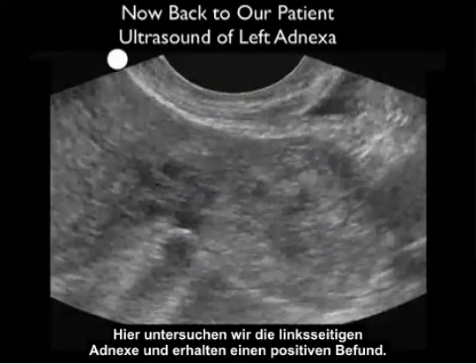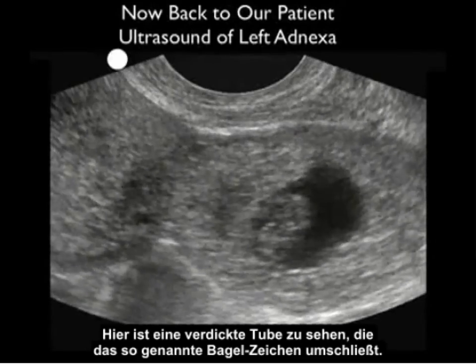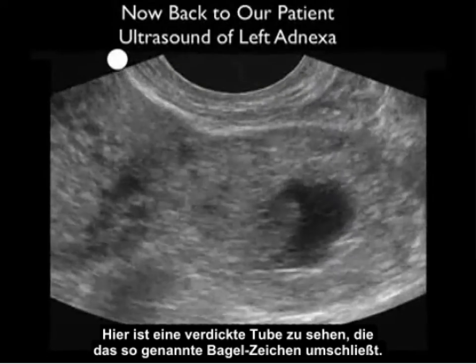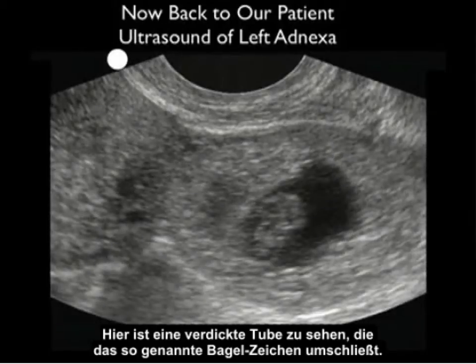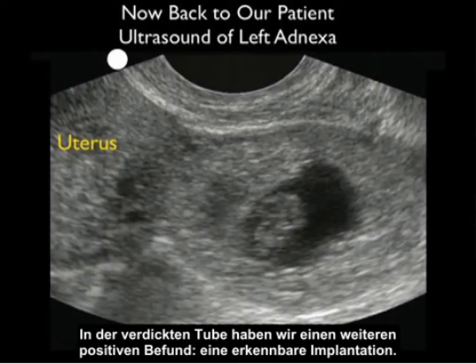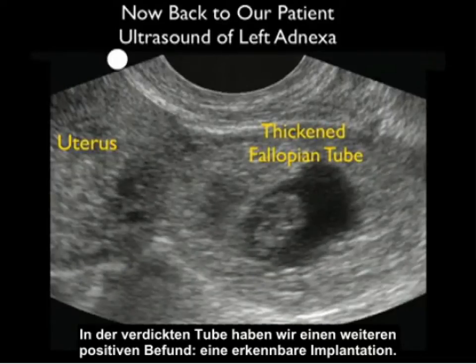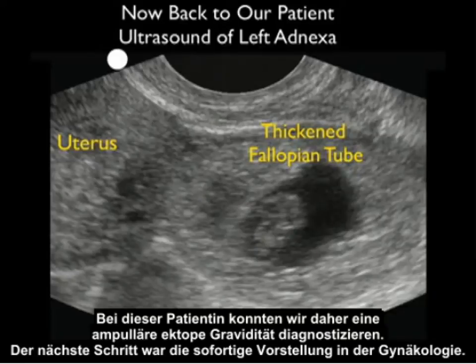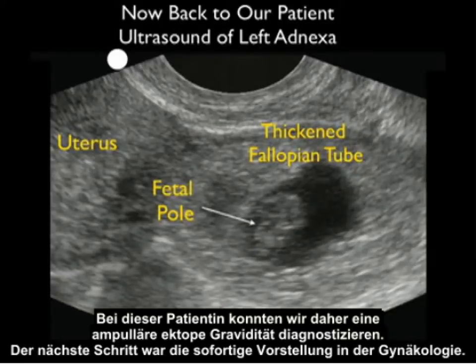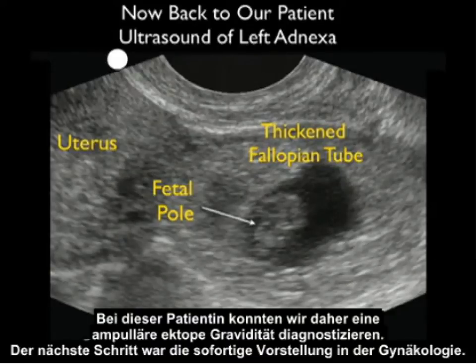Scanning out to the left adnexa, we have a positive finding. What we see here is a thickened fallopian tube comprising what is known as the bagel sign. And notice within the thickened fallopian tube, we have another positive finding — the presence of a fetal pole. In this patient we were able to diagnose an ampullary ectopic pregnancy, and our next move was to call OB-GYN STAT for a consultation.